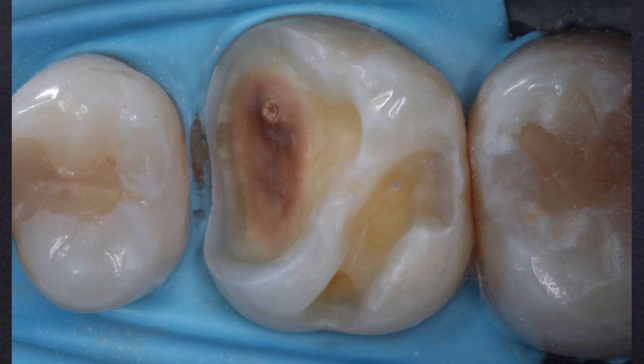On your screen you should see a photo of — that's a big restoration. So you're having a great day at the office and then you walk into the operatory and you're facing this. How do we restore that with a sectional matrix system as quickly and efficiently as we can and provide a good result for the patient? Certainly there are cases like these where potentially you're going to recommend a crown. We're unable to ask the doctor why he or she chose to do this as a direct restoration versus a crown, but whether it's monetary concerns of the patient or some other mitigating circumstances, here you are, facing this type of restoration.